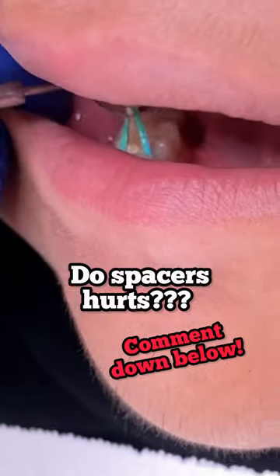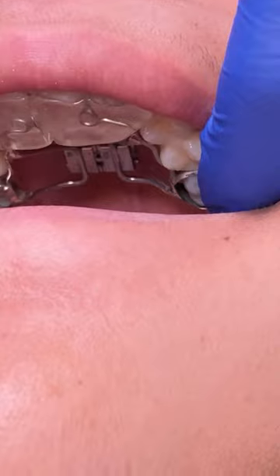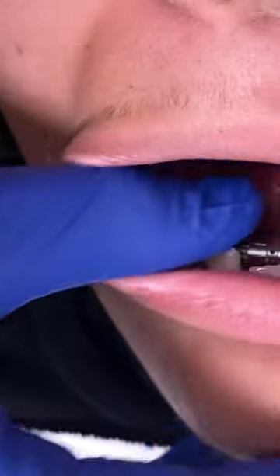Right here we are going ahead and trying on the appliances, making sure that they're sitting correctly, and then once they're seated correctly we're going to go ahead and cement them on.